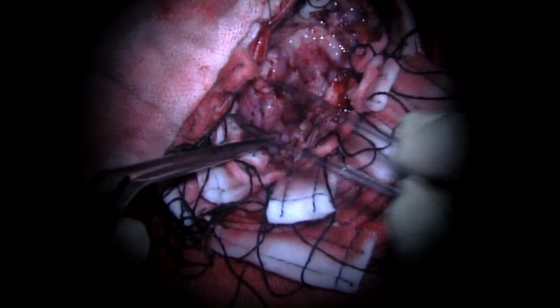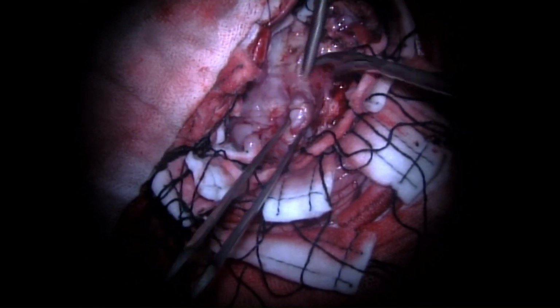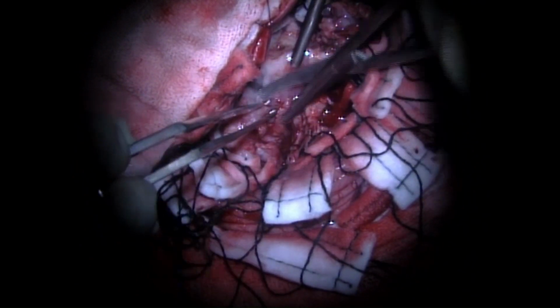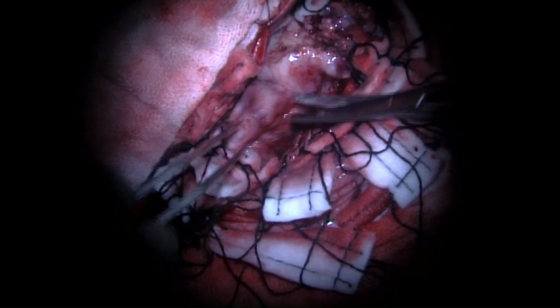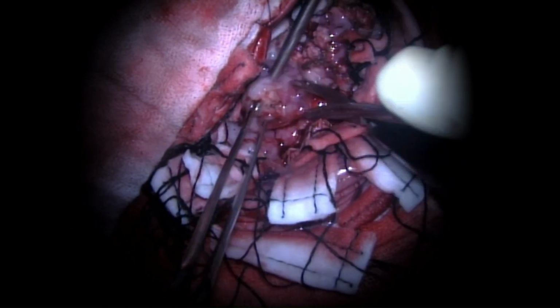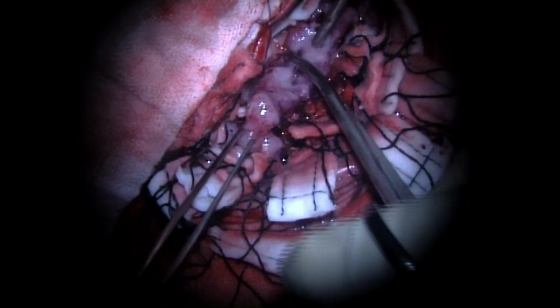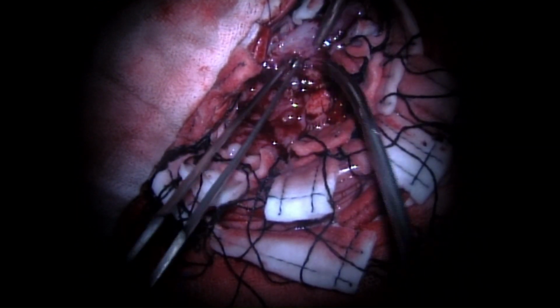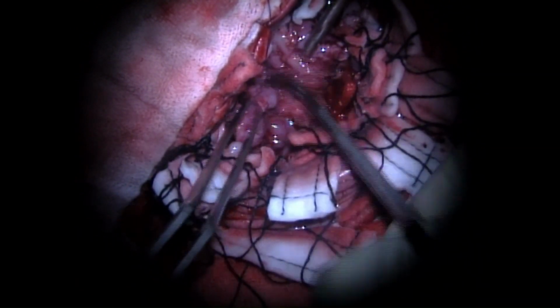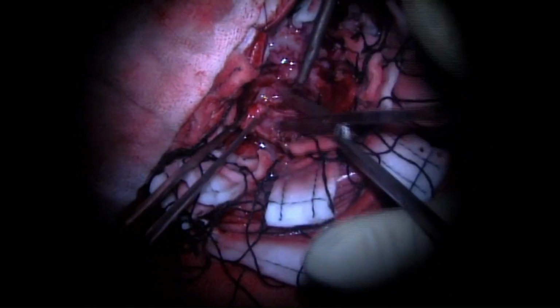Again, you can see this familiar sequence where I'm using cottonoids to develop the interface, or exploit the interface, between the tumor and the normal brain parenchyma, and then coagulating the tumor and cutting it down into small pieces with the help of scissors, then resecting and removing those pieces from the surgical field.